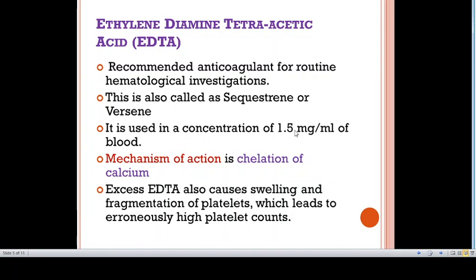Its mechanism of action is chelation of calcium. The proportion of anticoagulant to blood should be maintained. If EDTA is in excess of 2 mg per ml, it causes shrinkage and degenerative changes in red cells and white cells, resulting in decreased hematocrit and increased mean corpuscular hemoglobin concentration. Excess also causes swelling and fragmentation of platelets, which leads to a very high platelet count.